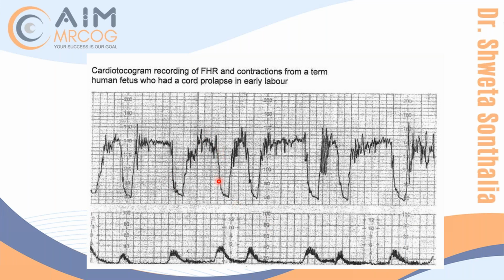If it is a late deceleration so deep, will the variability be normal? No. It's an acute drop, first of all. It's not a gradual drop. It's an acute drop. Do you agree with me now? Yes, ma'am. You see how I changed your mind in less than 30 seconds?